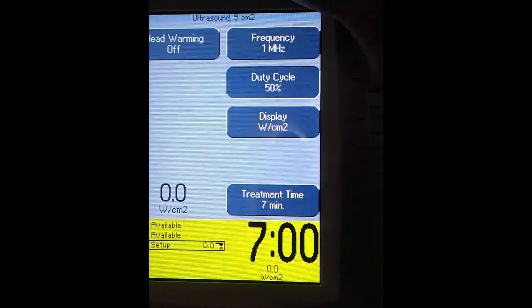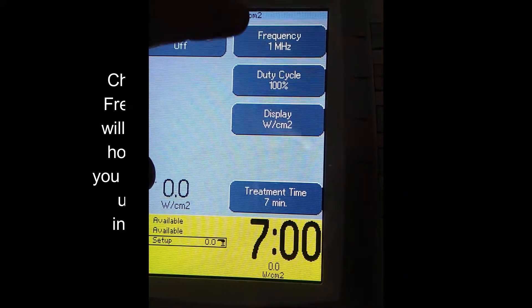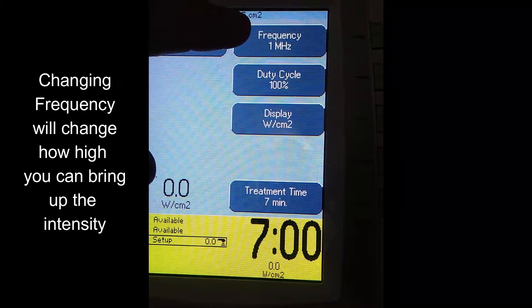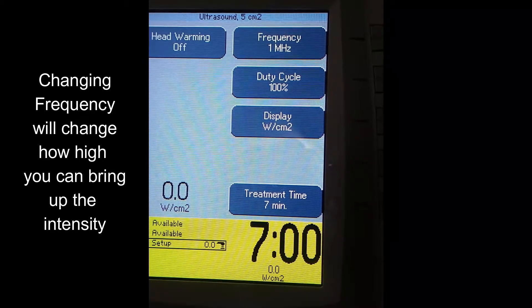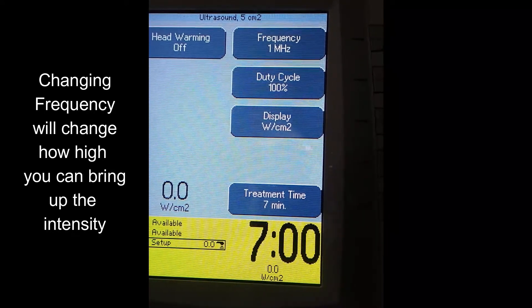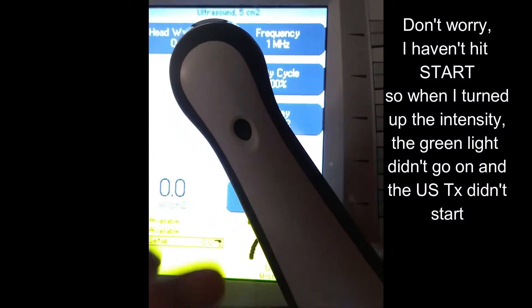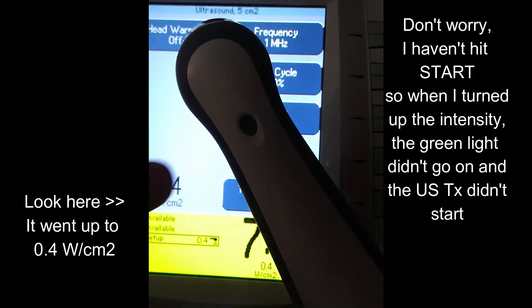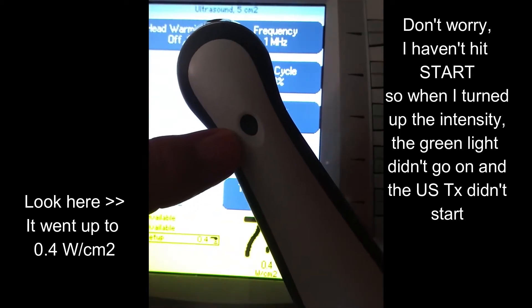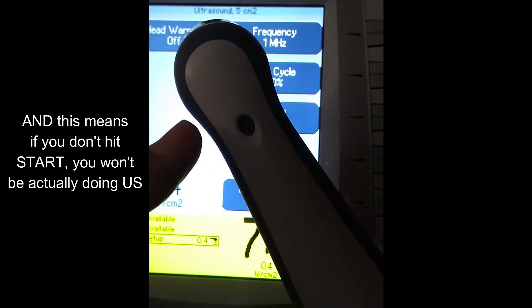Let's go back to 100%. I want to show what happens when you change frequency and how you get different intensity limits. My ultrasound head is plugged in, but you'll notice there's no output shown. I'm turning up the intensity — you can see the dial going up. The green light didn't go on, which means there's no therapy. So until you hit Start, there will be no treatment.